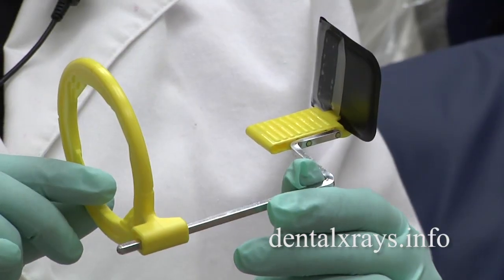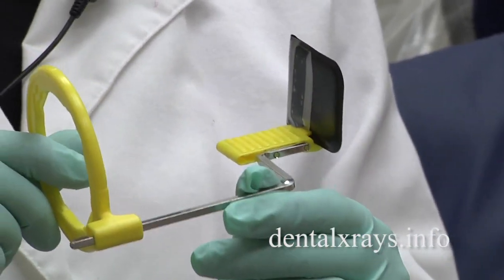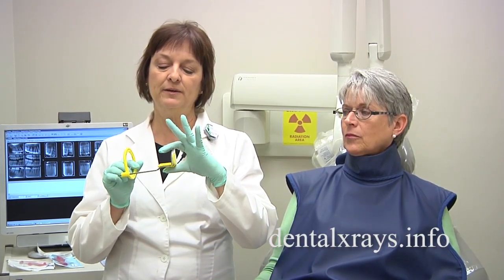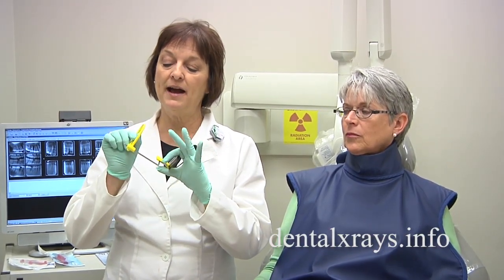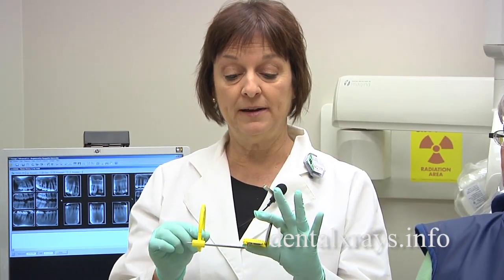Many offices use the ring instruments, which helps with bisecting angle because it's doing all the work for you. When you use a ring and the film slants in the mouth, the bar is telling you exactly what angle to use. Using the rings eliminates elongation, foreshortening, and overlapping.